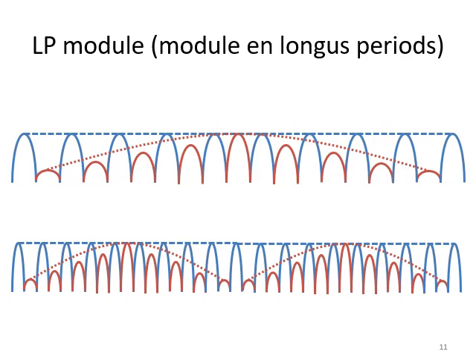So one MF version has a sustained intensity and another MF, which is the pulses are coming in the interval phases of the first MF. They have progressively increasing and decreasing intensities.